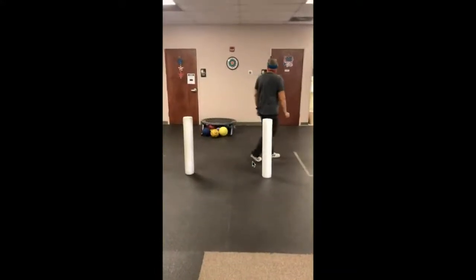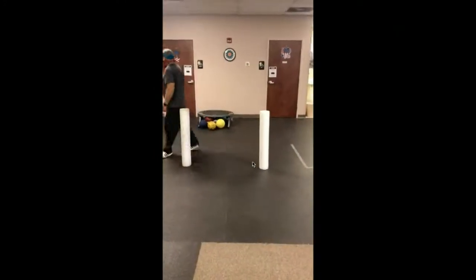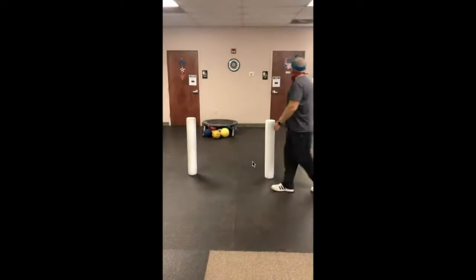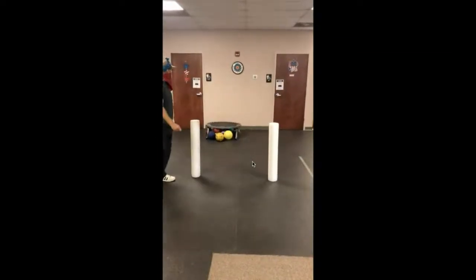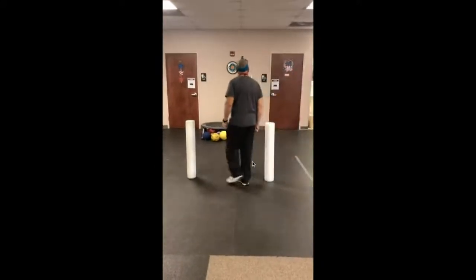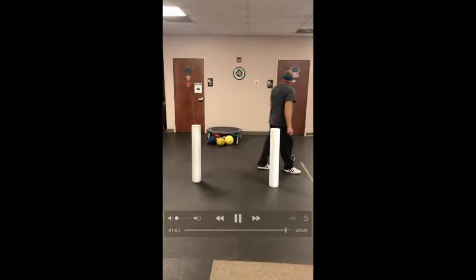So again, he has some changes on that right side when he's working through dynamic system balance and vestibular activities. So that's what we end up working on. That was much better that time, giving us some feedback. I need you to get that laser on the target much sooner as you turn around. And if that makes him dizzy, there we go. Then we do that until his tolerance is low, let him recover, and then try that again.